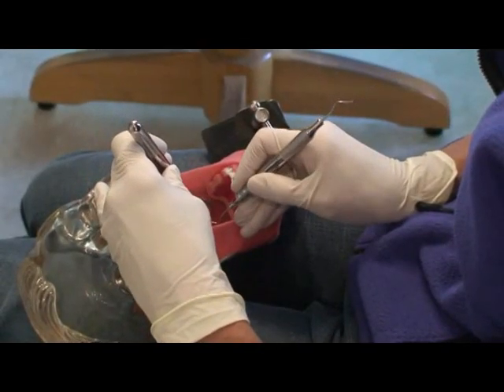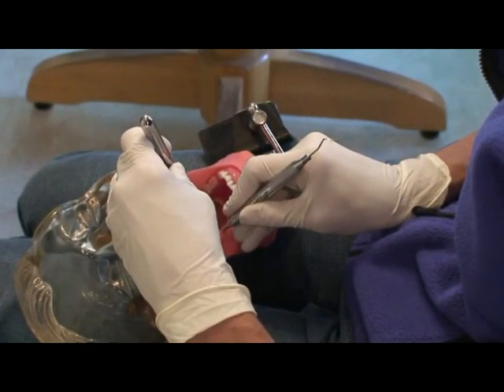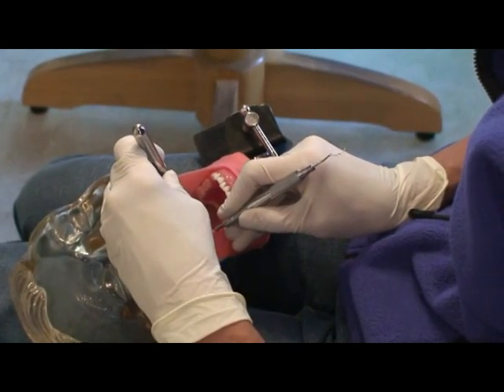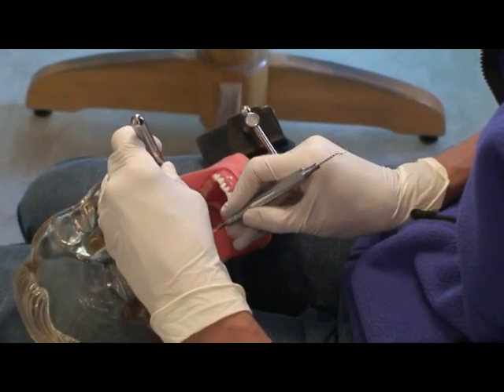Upper right lingual, have the patient turn towards you. Extraoral fulcrum. The head turned toward you and then slightly lift it up.